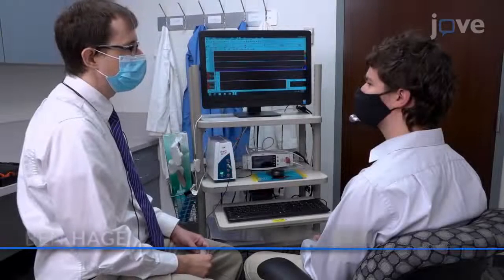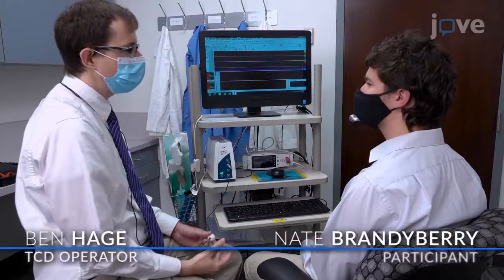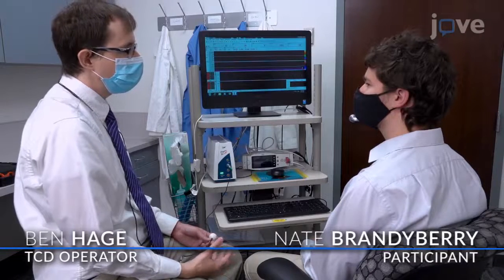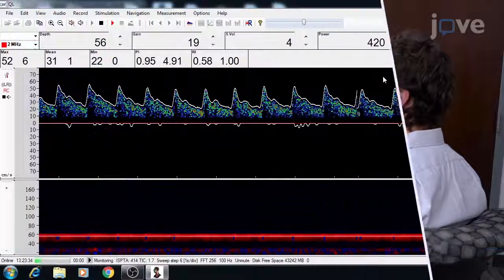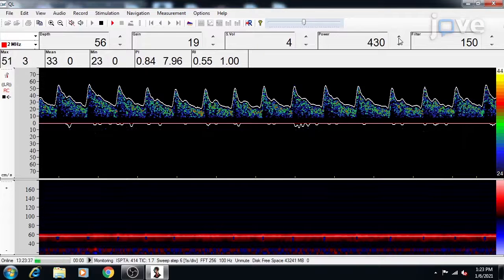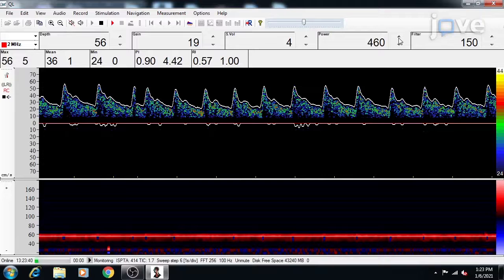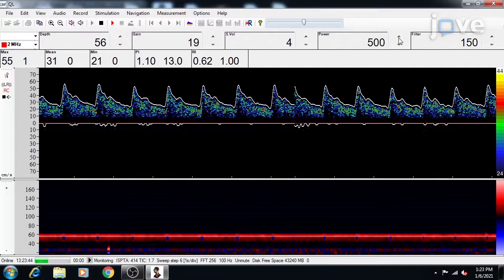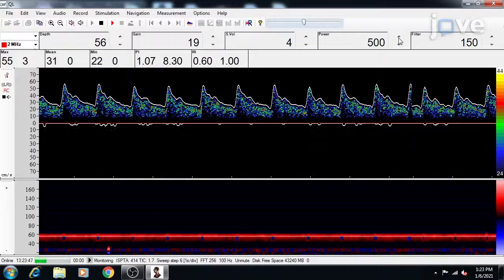Begin by setting the parameters for Transcranial Doppler Ultrasound, or TCD. Keep the power at a reasonably high value during the initial search for the middle cerebral artery, or MCA. Once the MCA signal is located, reduce the power as much as possible while still maintaining a good signal.